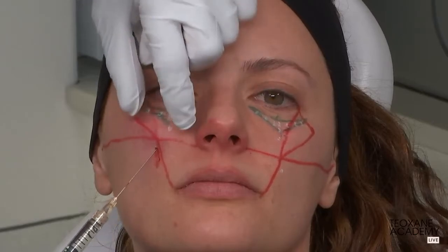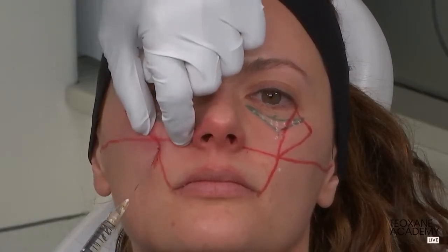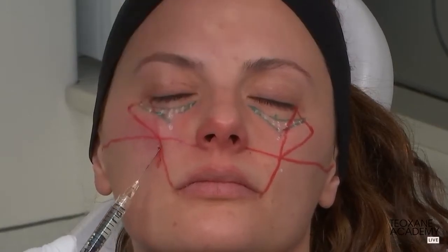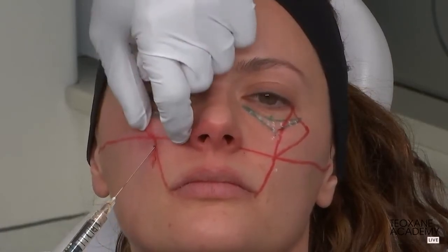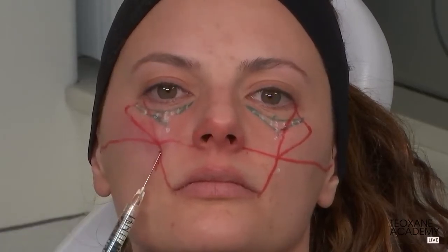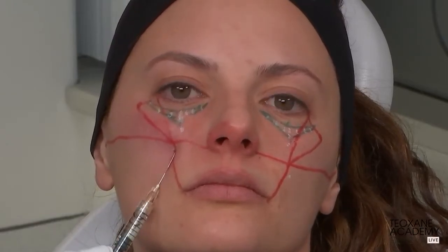Dr. Bernardini, we have a question coming in from our viewer. Okay, go on. Is your technique adapted to any tear trough? And could you specify if there are bad indications for the treatment of tear trough with your technique? Well, I'll be replying to that question in just a second, but without stopping.